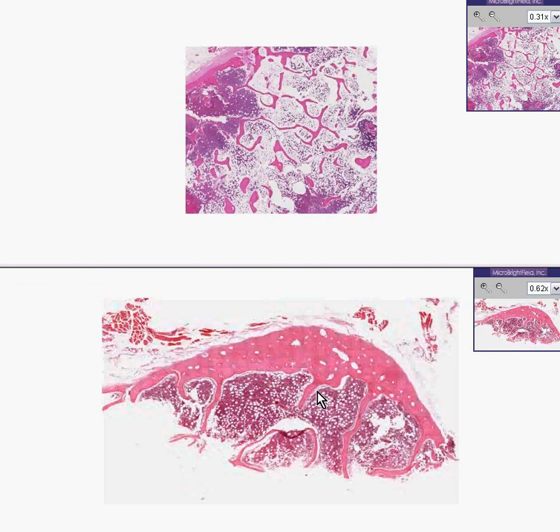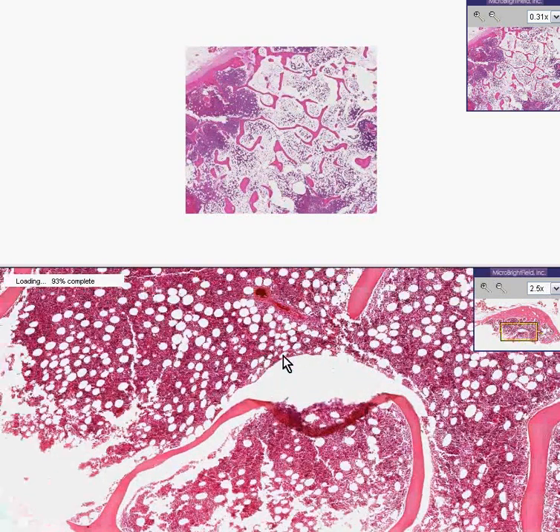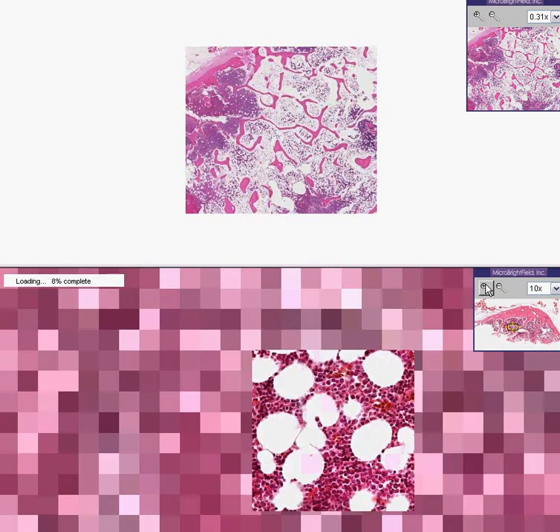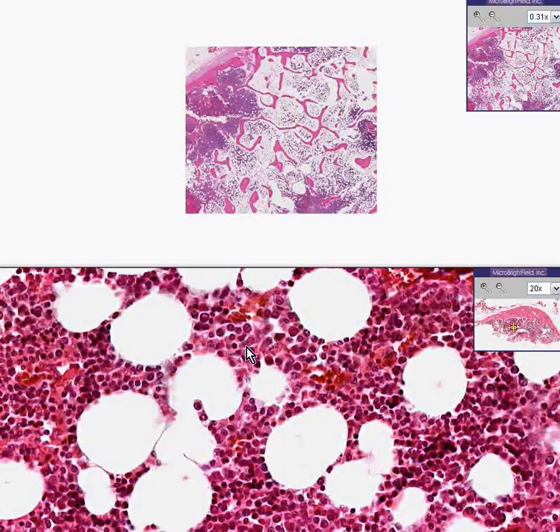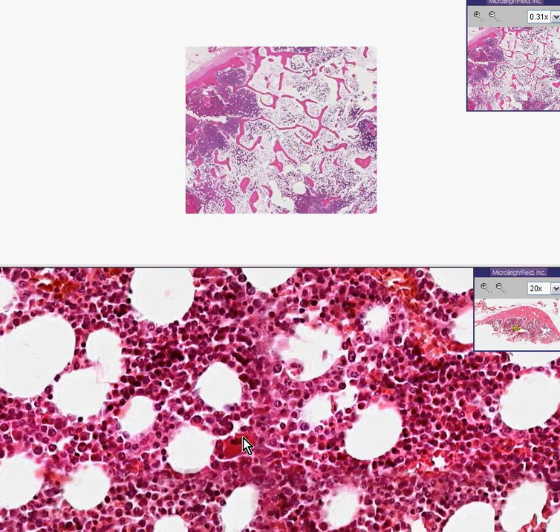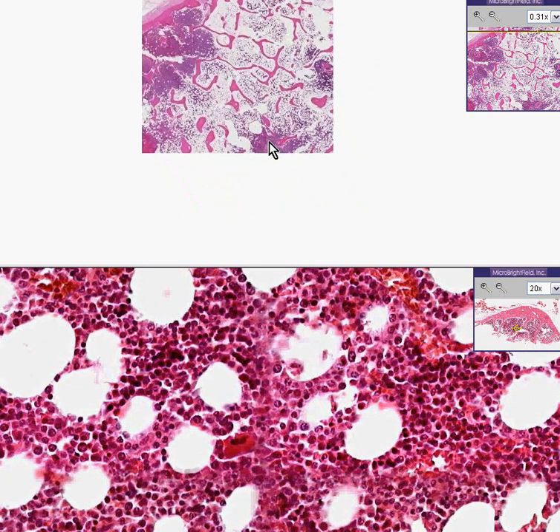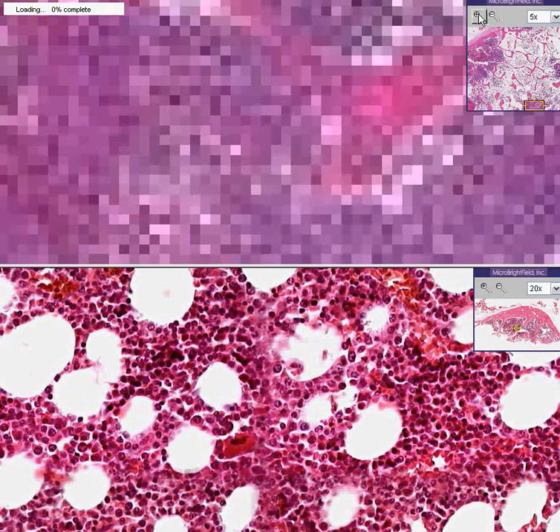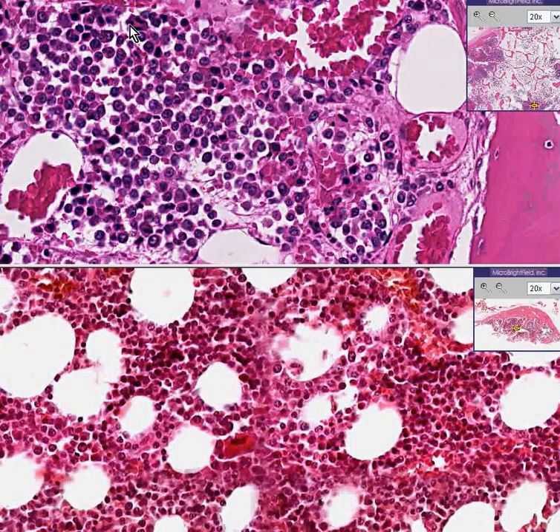Here is a normal bone marrow. Notice that in this bone marrow it's about a 50-50 ratio between hematopoietic cells and fat. No matter where you go in this bone marrow, you will see that the cells are all different — there are more white cell precursors than reds, and you see occasional megakaryocytes. This is a heterogeneous population of cells. In contrast, in many marrow proliferative diseases, including multiple myeloma, all the cells look like each other because they all are the same type of cell. This is a monoclonal proliferation of plasma cells.